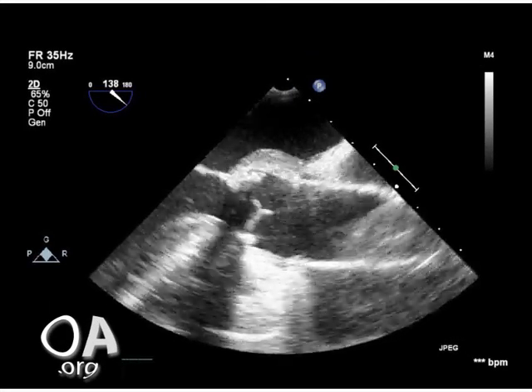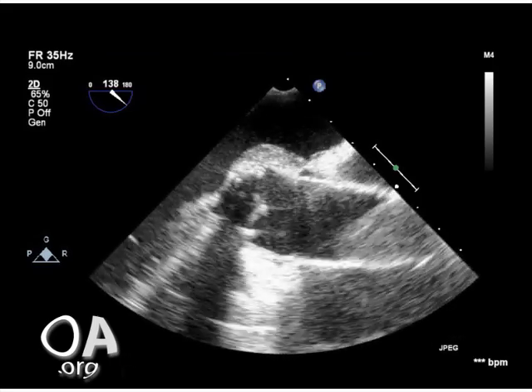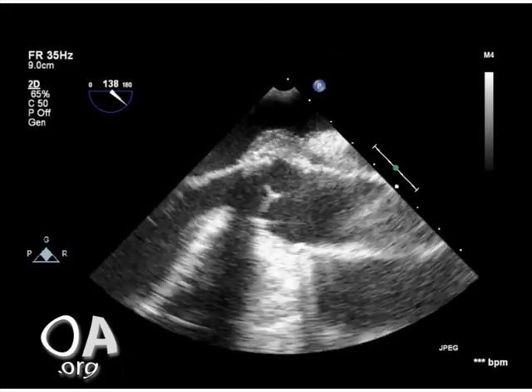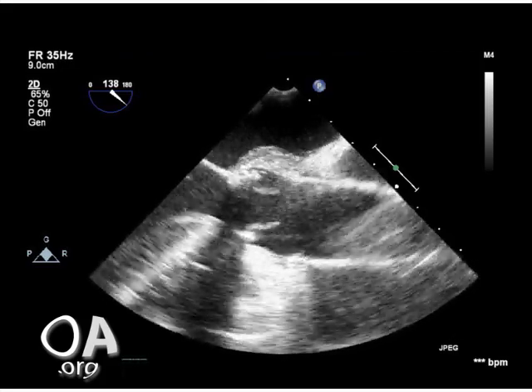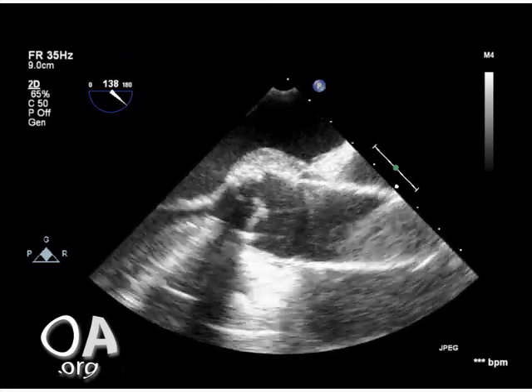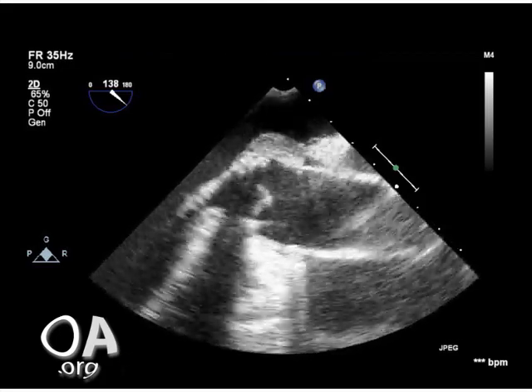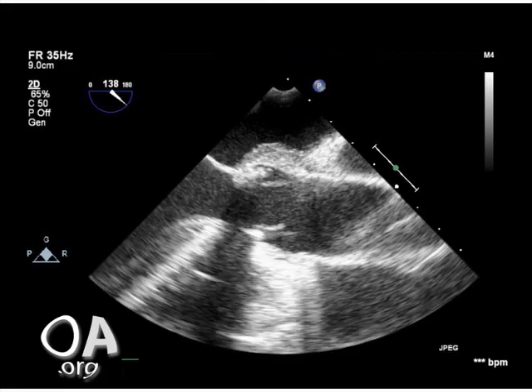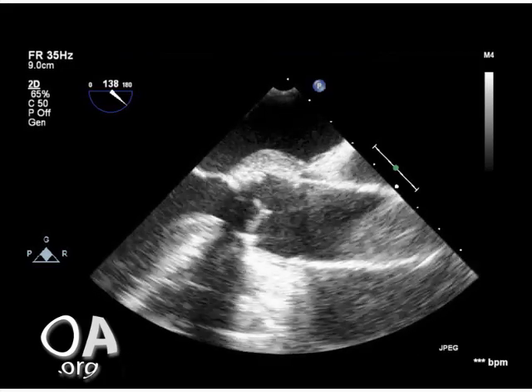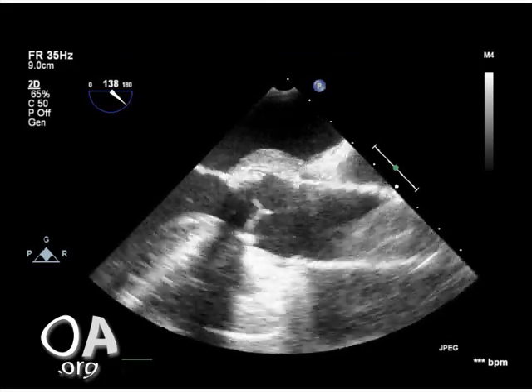This is a postoperative image in the operating room after the valve replacement and ascending aortic reconstruction. This is the mid-esophageal aortic valve long axis view, this time closer to 140 degrees multiplane angle. The new valve causes some artifactual shadowing seen as vertical streaks which cause impairment in imaging in the far field. Also visible is the new graft material of the aortic reconstruction. The walls of the aorta now appear bright white, and there is loss of the normal sinotubular junction of a normal native aorta.